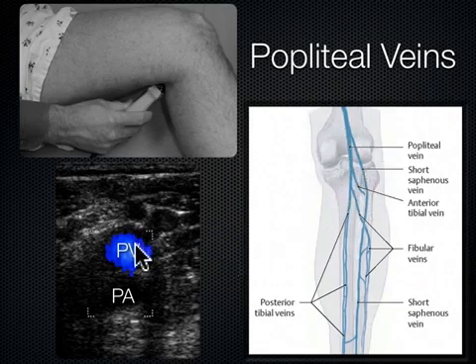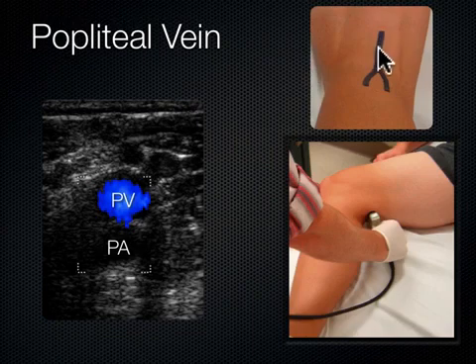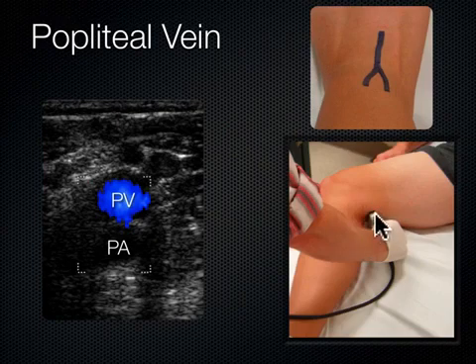And so here's the popliteal vein, here's the popliteal artery, the vein comes to the top in the pop. That's how you can remember that. And again, it's this sort of bifurcation that occurs. That's sort of the area that you're going to be looking at. This is my right hand holding the transducer. The patient's leg is externally rotated. They're still kind of sitting up in the bed or lying supine, either way, but you're going to externally rotate their leg. You're going to have their knee flexed. And in that position, I can get good access to their popliteal fossa.